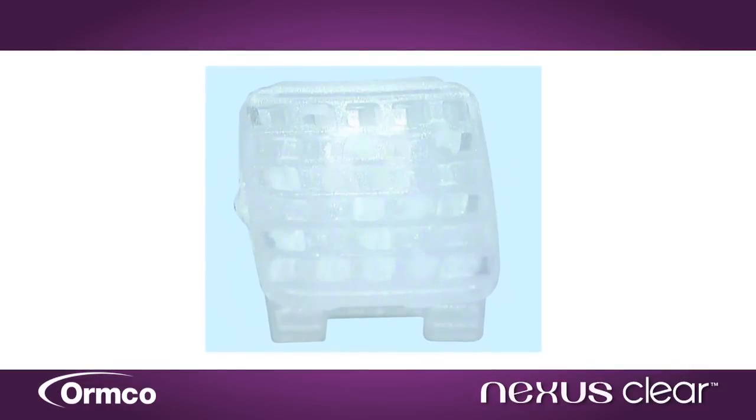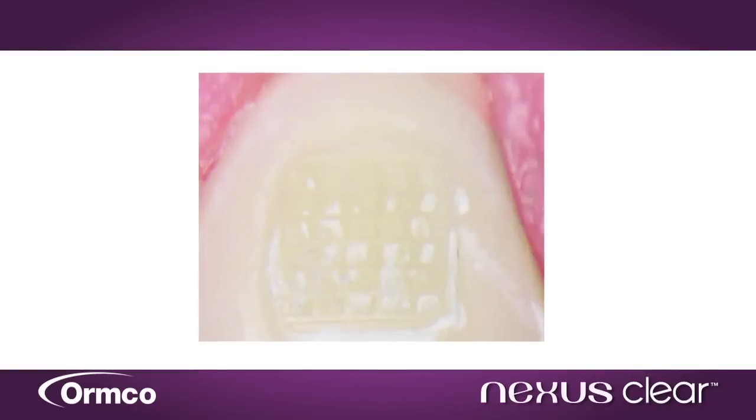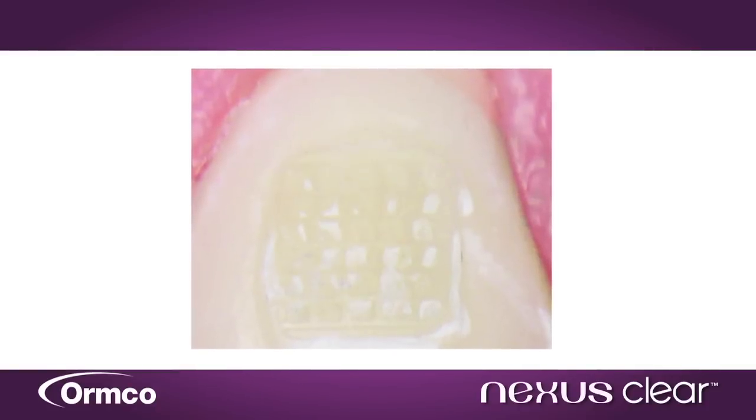Meanwhile, the patented Nexus Clear base is designed to encourage adhesive to remain on the tooth during removal, so cleanup is simple and enamel is preserved.